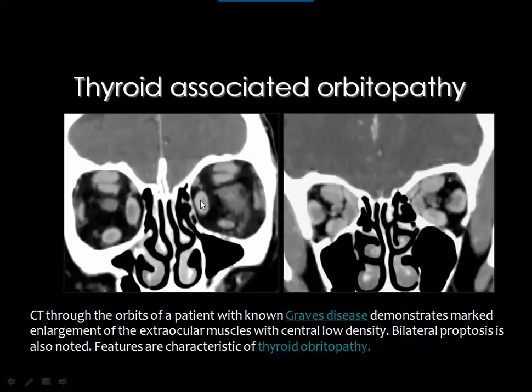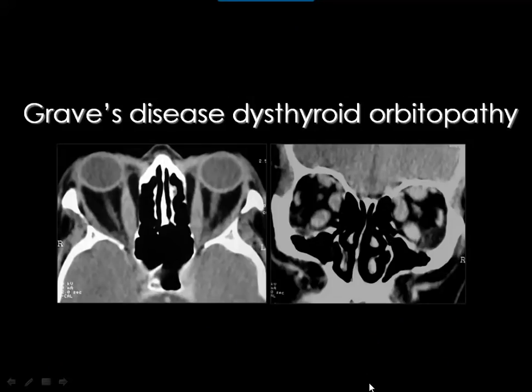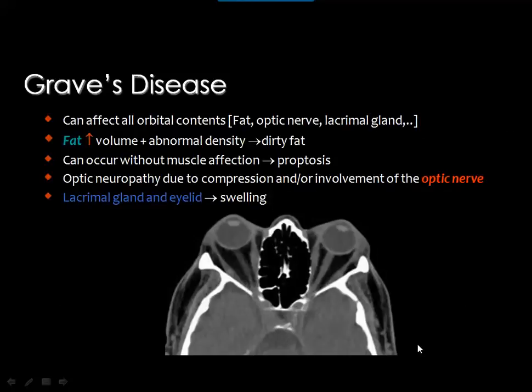You can see involvement of the medial rectus, inferior rectus, and superior rectus levator complex. Graves' disease also produces an increase in orbital content and orbital fat volume, which appears dirty due to reticulations and deposition of abnormal material. It can also affect the lacrimal gland, eyelid, and optic nerve, though the most commonly involved structures are the extraocular muscles and fat. Enlargement of the extraocular muscles may also cause compression of the optic nerve near the orbital apex.